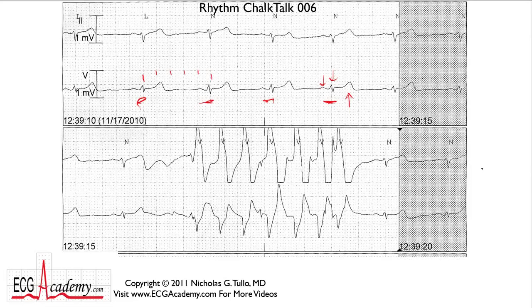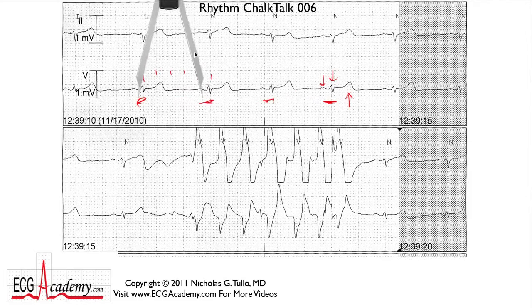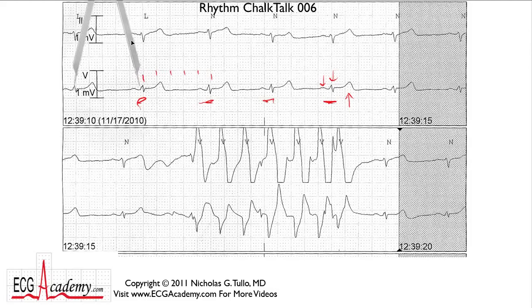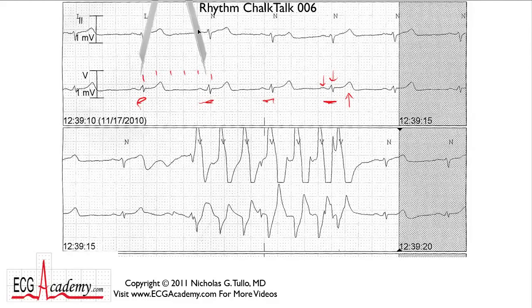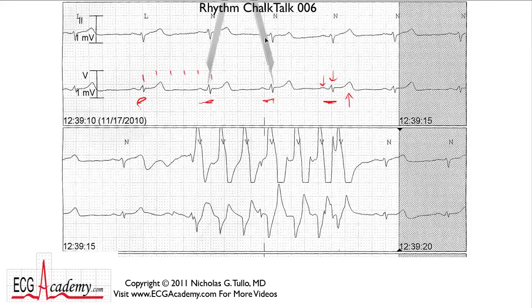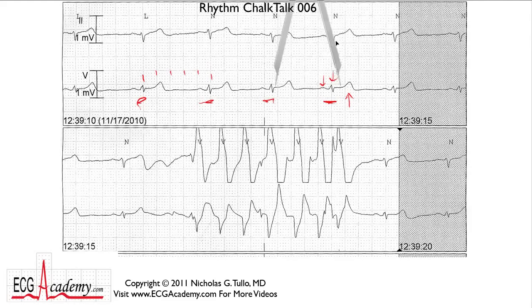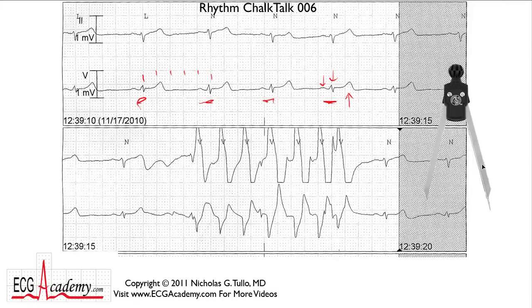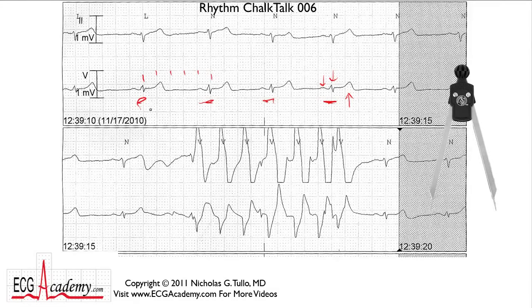It's a little irregular though, so let's take our calipers out and measure it. I set these calipers up for about 64 beats per minute. The first R-R interval is actually a little bit longer, then it comes down to 64, and then it looks a little bit faster. This R-R interval is a little shorter, as is this one, and then it gets longer again. What we have here is a very common abnormality known as sinus arrhythmia.